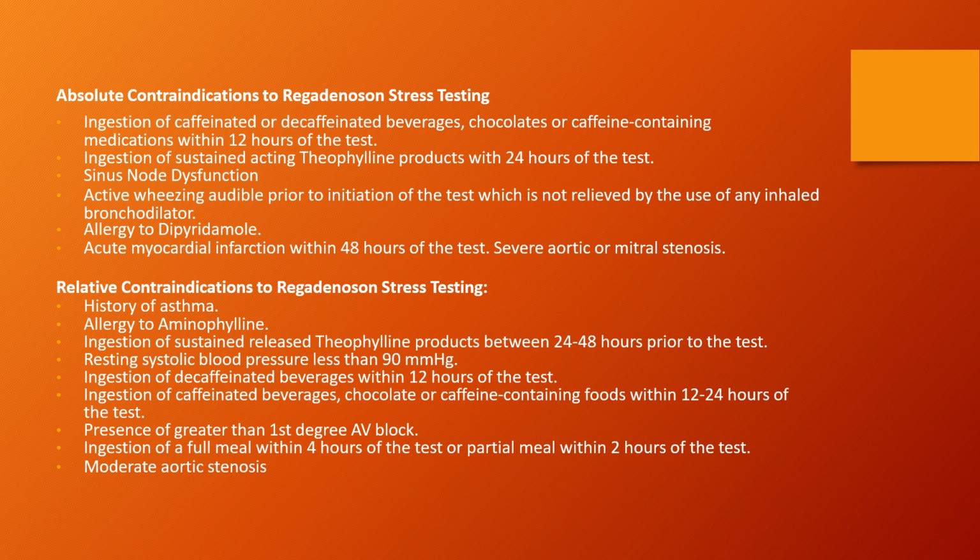I want to point out that the use of decaffeinated beverages and chocolate are also absolute contraindications, and that's because a lot of decaffeinated beverages actually have a little bit of caffeine in them, and that could result in the person being a non-responder, meaning they do not respond to the vasodilation.